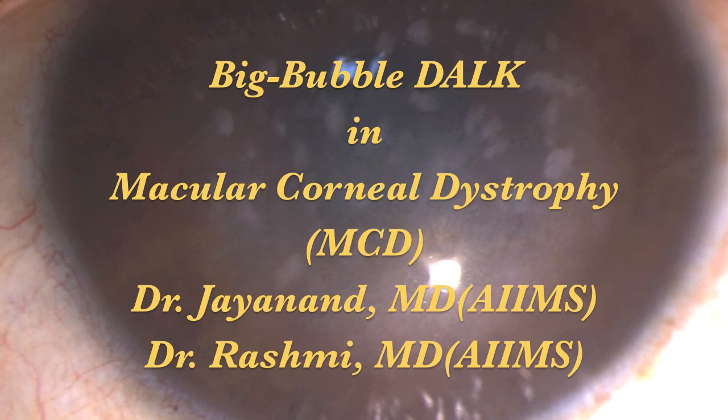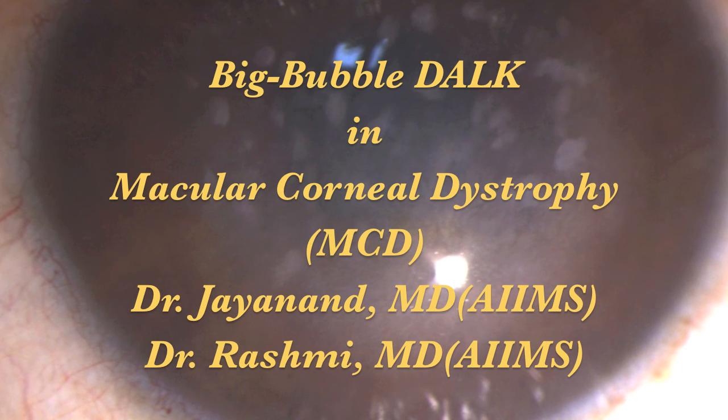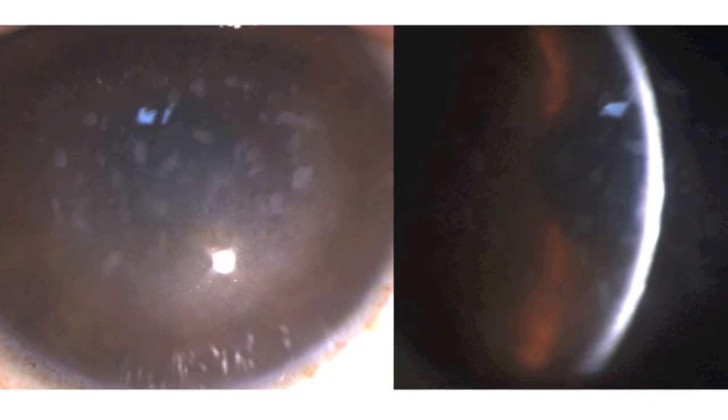This is a surgical video showing big bubble DALK in a case of macular corneal dystrophy. Clinical picture showing multiple stromal opacities with intervening haze.